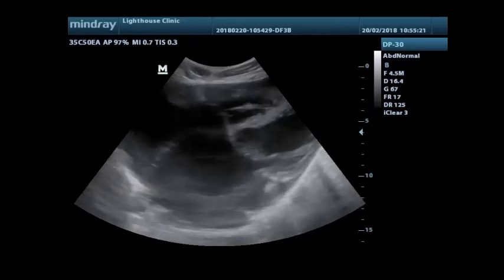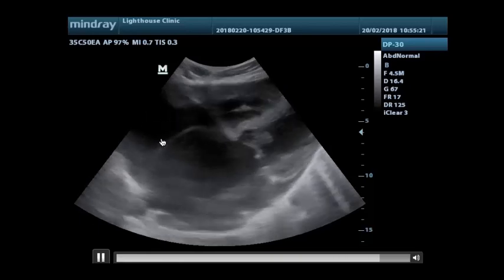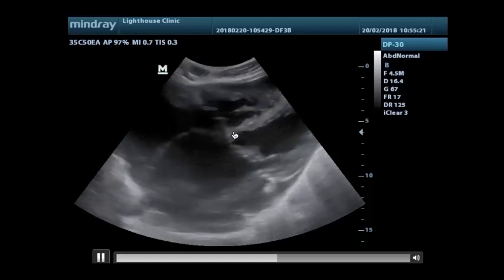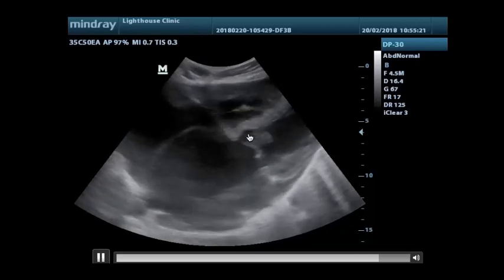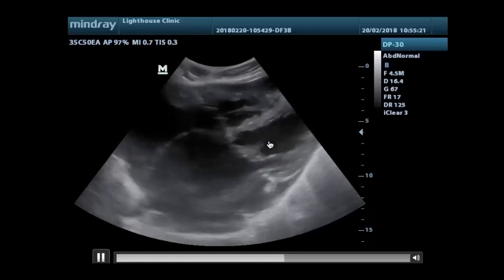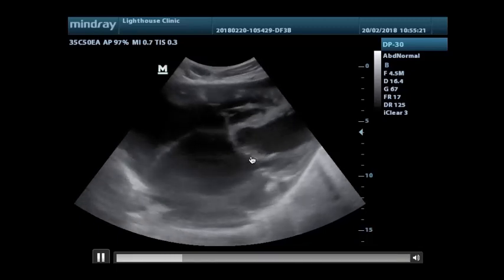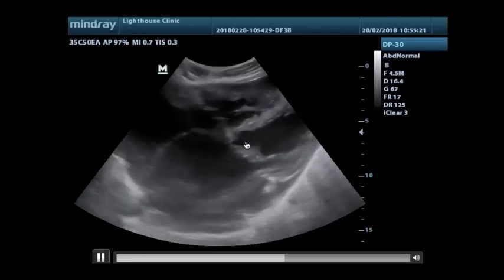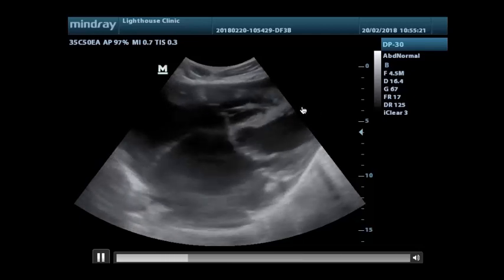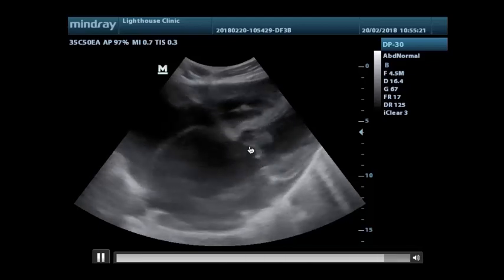Here is another example. Again, a different patient, where we see the right heart on this side, the left heart on this side with the left ventricle, and the larger, roundish, blown up balloon of a left atrium. And again, as we look at the mitral valve, there are structures, there are appendices, it seems thickened, it seems just more prominent, and it seems not to open properly. But that is not what I want you to look at. I want you mainly to look at the fact that this is larger than this. So there must be a reason, and the main reason is the stenosis in between.